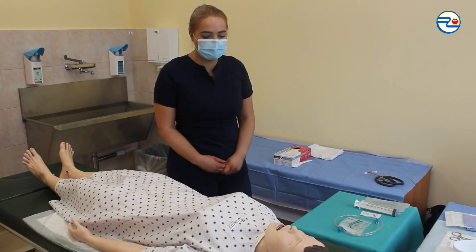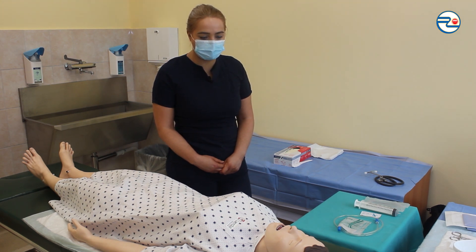Hello, I'm a sojourn. My name is Eglia Kubiliute. What are your first and last names? You can't swallow food, so I will insert a tube through your nose to your stomach for nutrition. Do you agree?